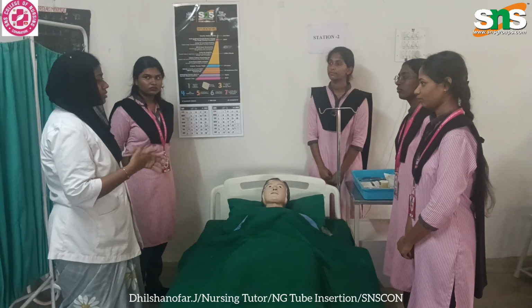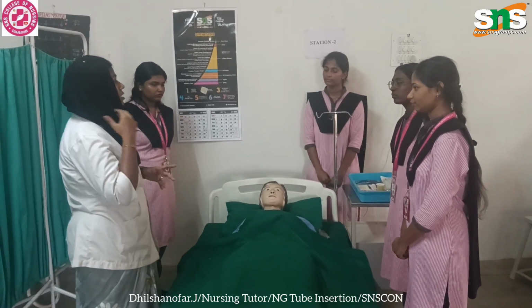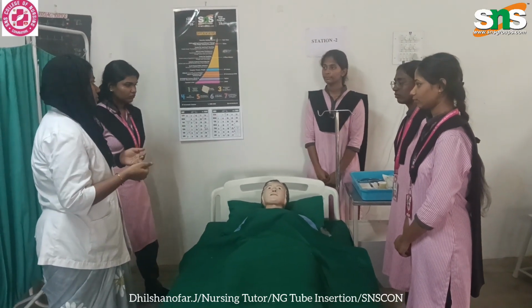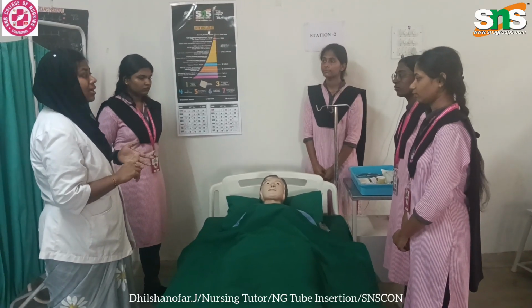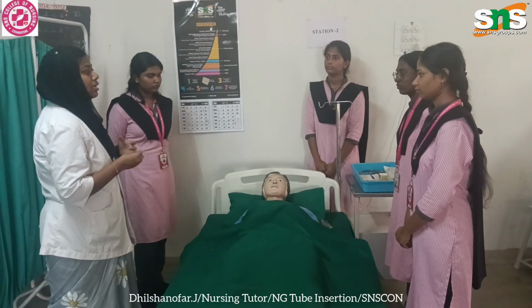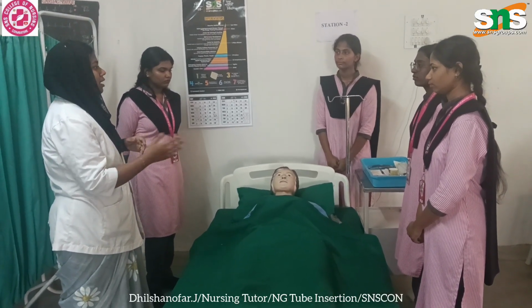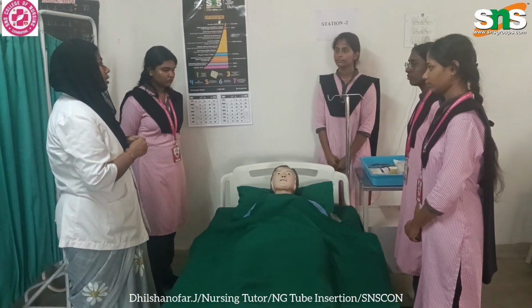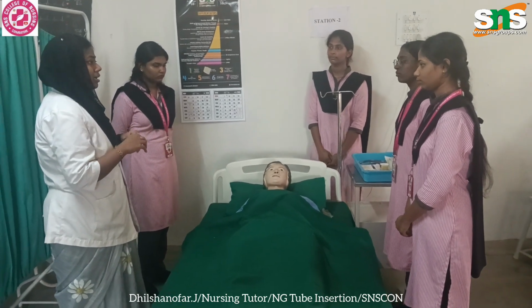That's it. Next is how we are going to do the procedure. I will explain, you just demonstrate on the dummy. So first thing is we have to check the doctor's order whether it is needed for the patient or not. Then we have to get consent from the patient and the patient attendant. If the patient is unconscious, you can ask the attendants, and we have to explain the procedure to the patient or to the client first. After explaining, you have to get the consent form.